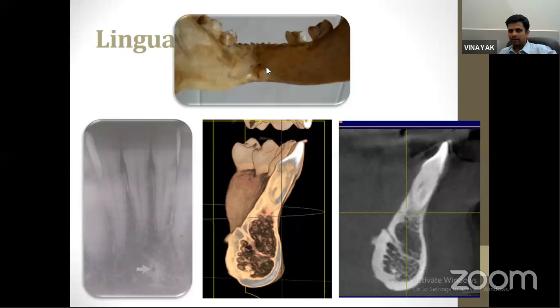So if we impinge on it, and if there is bleeding, because the lingual vessels come out from this, then it leads to a life-threatening condition. A sublingual hematoma is formed, the tongue is raised, and it is an emergency, and you will have to stop it from your carotid. You cannot directly compress it because it is opening outside the bone, right? So it cannot be compressed or stopped. So it is very important.